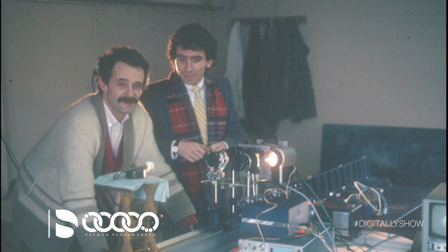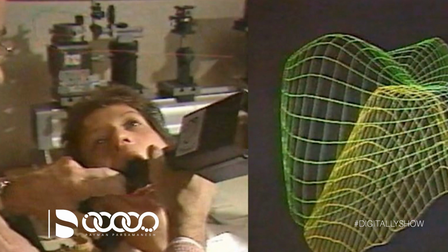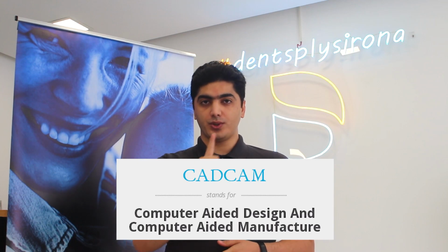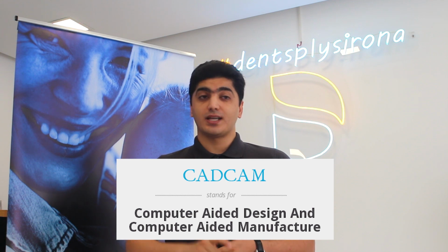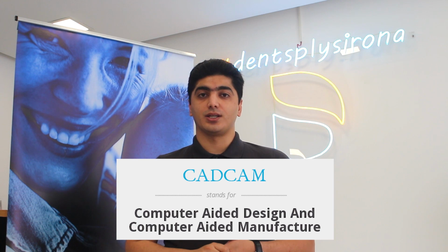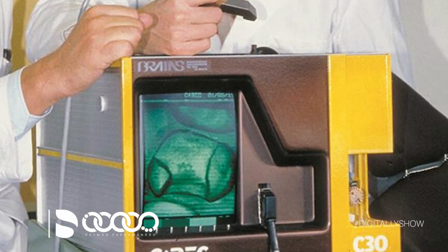Dr. Francis Duret of France was the first person to develop a dental CAD/CAM device, making crowns based on an optical impression of the abutment tooth and using a numerically controlled milling machine as early as 1971. CAD stands for Computer-Aided Designing and CAM stands for Computer-Aided Manufacturing, and this is how single-visit dentistry or one-day dentistry was created. Dr. Mormann was the developer of the first commercial CAD/CAM system.